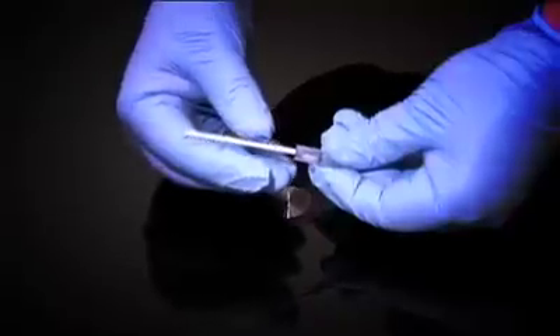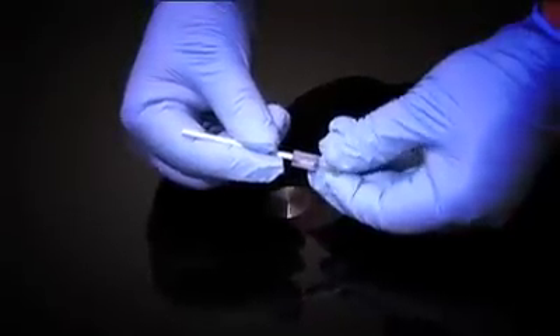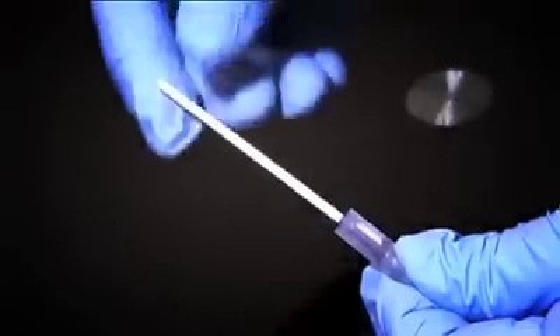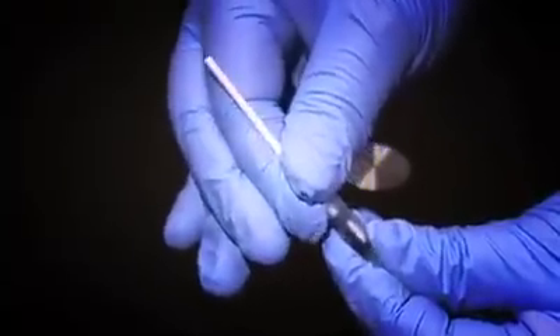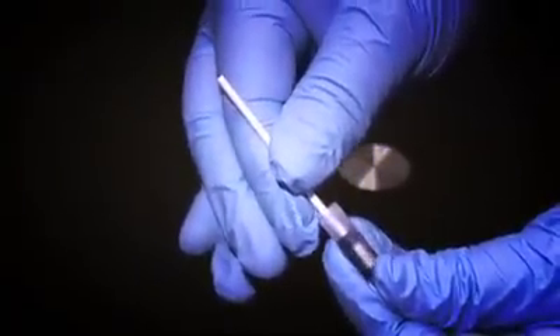To activate, hold the ampoule in one hand while gripping the swab as close as possible to allow maximum control. With a positive push, the inner cartridge will release and allow the phenol to impregnate the cotton swab.